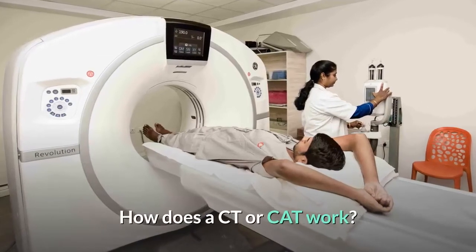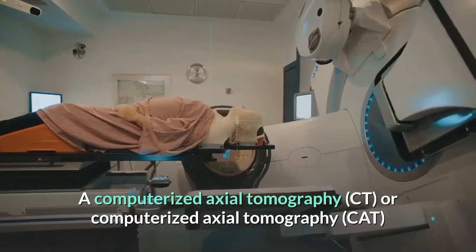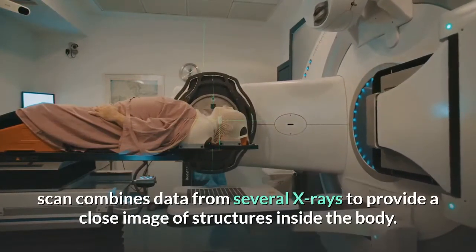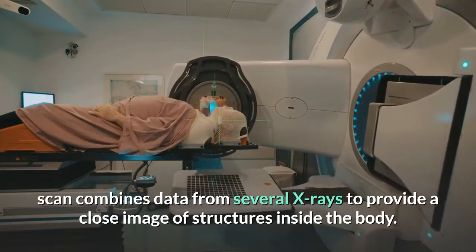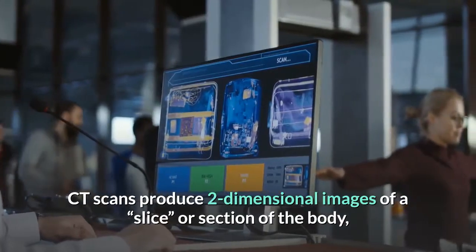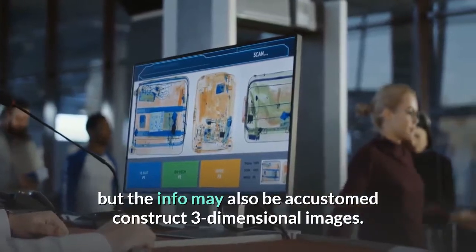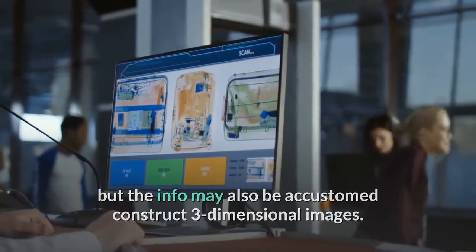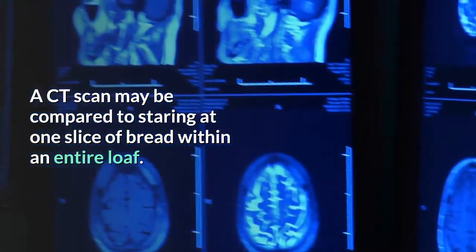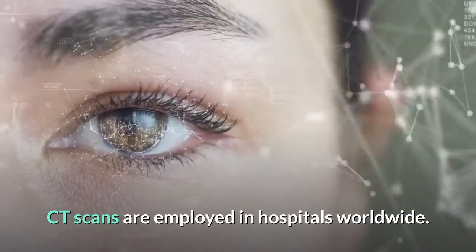How does a CT or CAT work? A computerized axial tomography (CT or CAT) scan combines data from several X-rays to provide a close image of structures inside the body. CT scans produce two-dimensional images of a slice or section of the body, but the info may also be used to construct three-dimensional images. A CT scan may be compared to staring at one slice of bread within an entire loaf. CT scans are employed in hospitals worldwide.